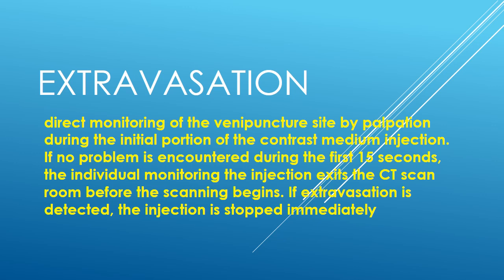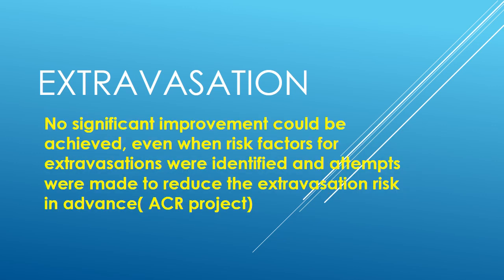In any case, your scanning will start about 15 seconds after you have started the injection, so you are no longer in a radiation zone after that. Now, in the first 15 seconds, if you encounter extravasation, you stop the injection, obviously.